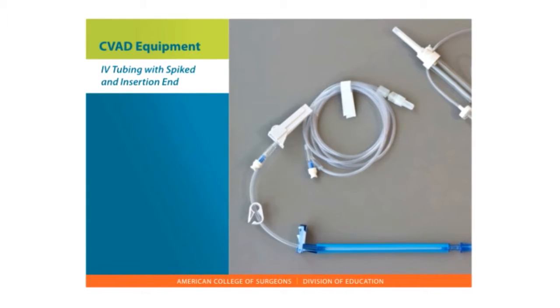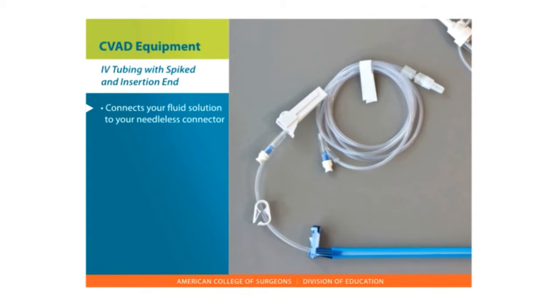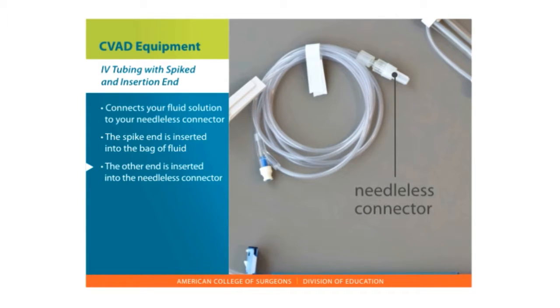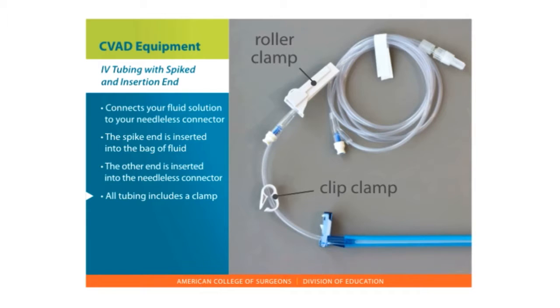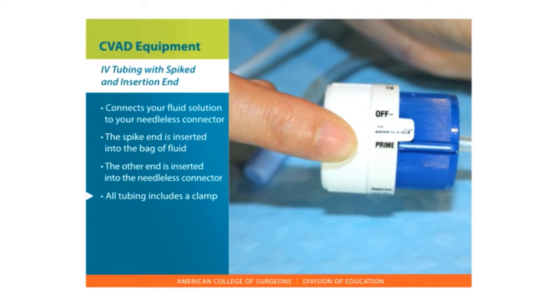IV tubing with spiked and insertion end. IV tubing connects your fluid solution to your needleless connector. The tubing has two ends — the spike end is inserted into the bag of fluid, and the other end is inserted into the needleless connector. All tubing includes a clamp that helps you control the flow of fluid. Some tubing contains a device so you can set how fast your fluid should flow.